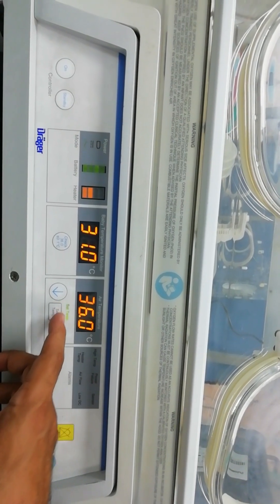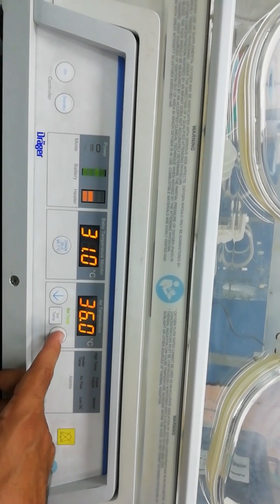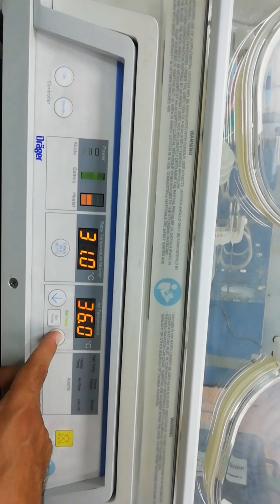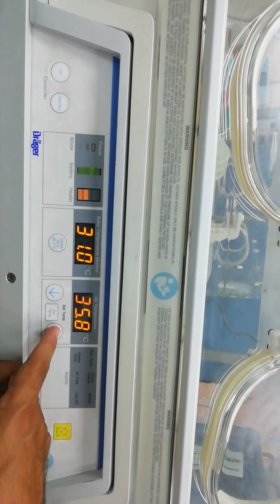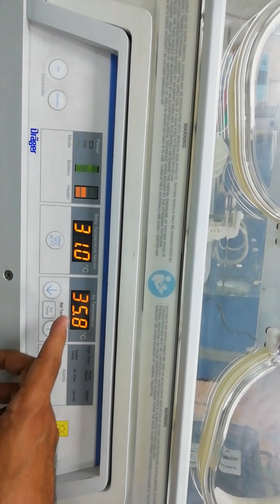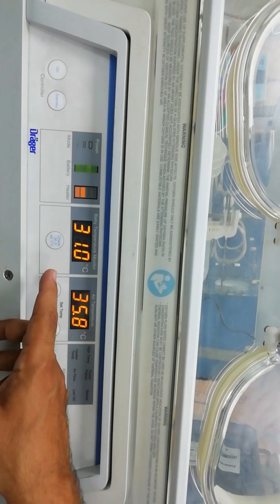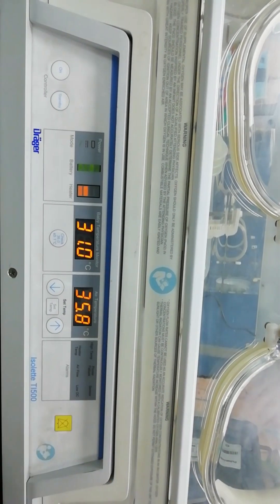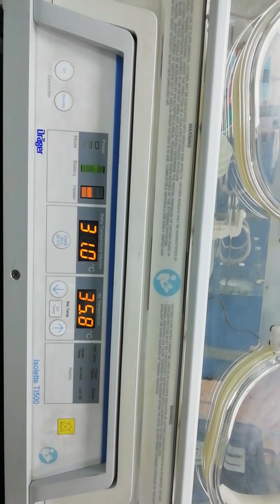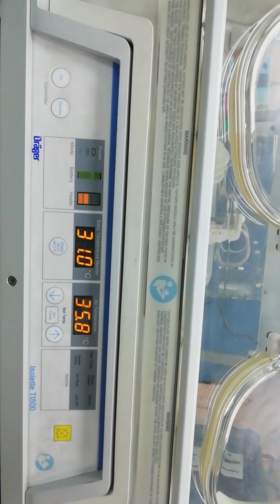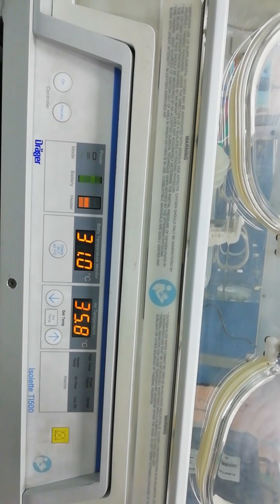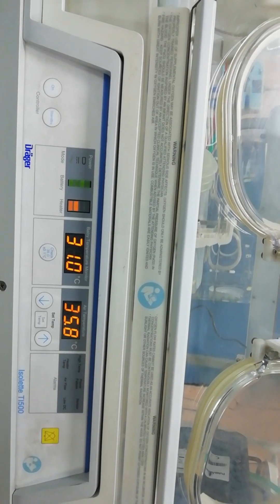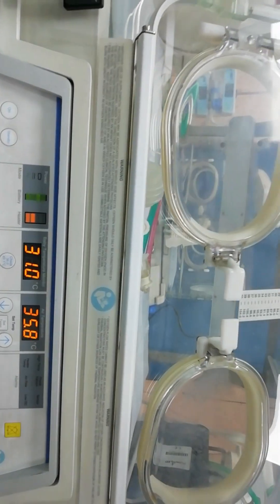When you see the green light you are able to increase or decrease the desired temperature. This part is for the baby temperature and this would tell you the baby's body temperature which is sensed by the sensor inside that I would show you later on.